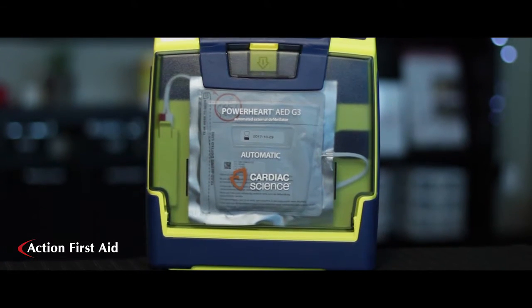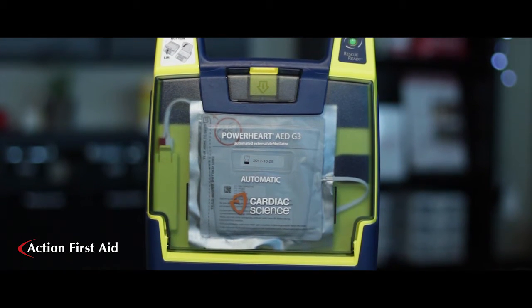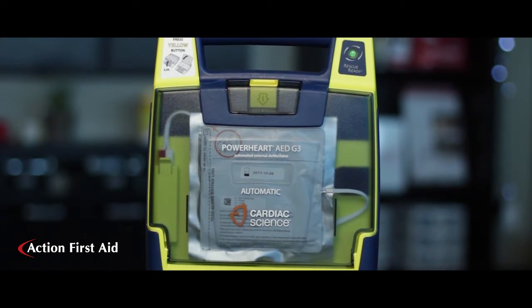You've invested in a really important life-saving device. These videos are designed to help you replace the pads or batteries for your AED.